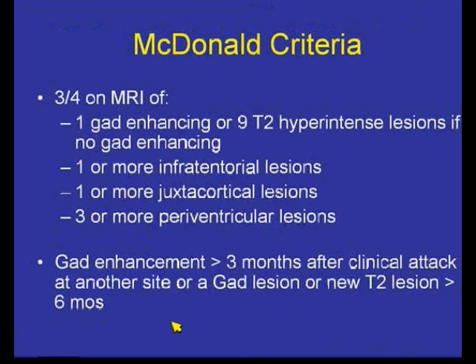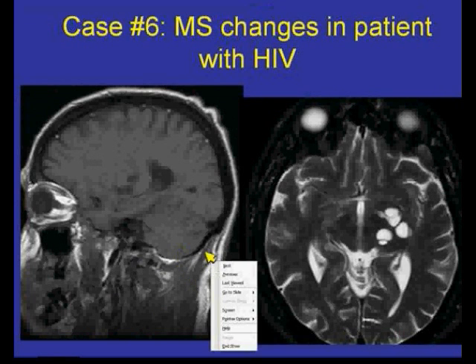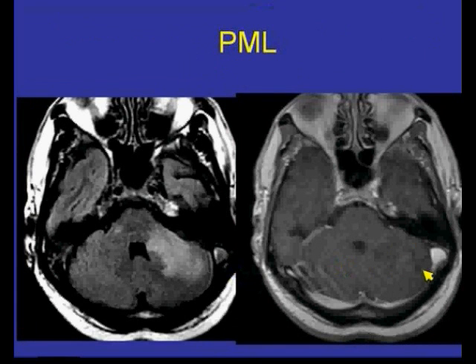The correct answer was number one — one or more infratentorial lesions. One of the distractors was PML. PML, in my experience, has been more of a posterior and often posterior fossa lesion, more confluent than multiple sclerosis and not usually your flame-shaped Dawson fingers. In this case, you see the absence of enhancement, although more and more reports indicate that PML may show some contrast enhancement.